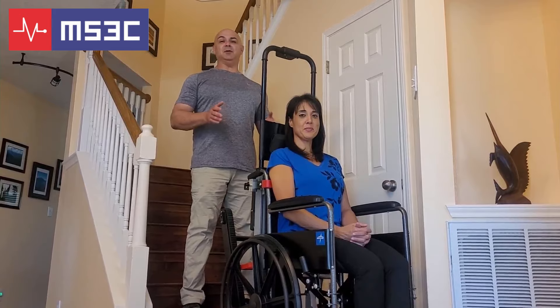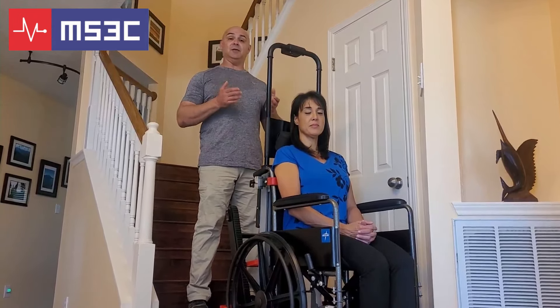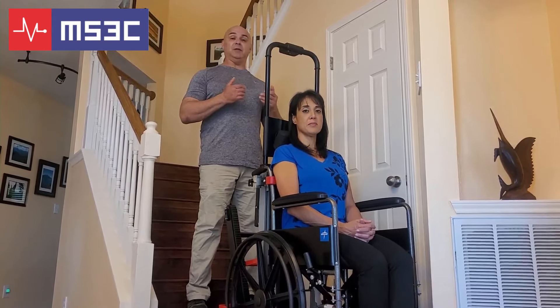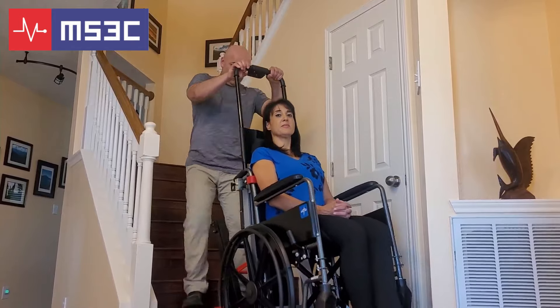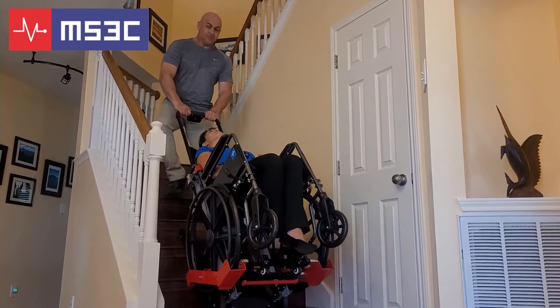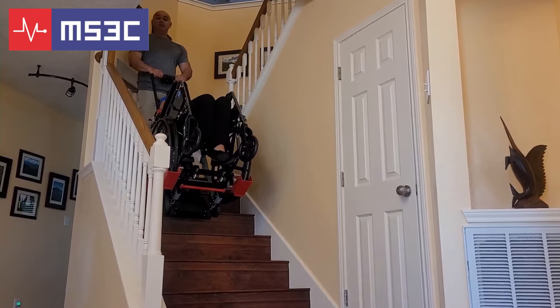Before you begin, please make sure that the wheelchair is securely fastened inside the trolley and the casters on the trolley are locked. Please keep in mind that the unit does all the work — you just have to guide it up and down the flights of stairs. When you are ready, begin by tilting the chair with the trolley backwards until the tracks are on the stairs. Then push the up button to ascend. To descend, simply push the down button.